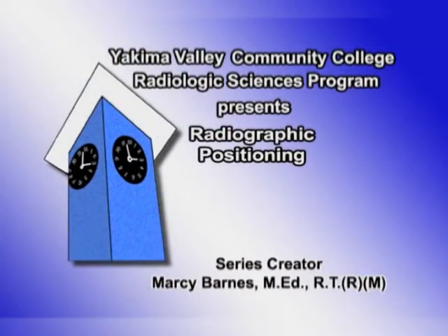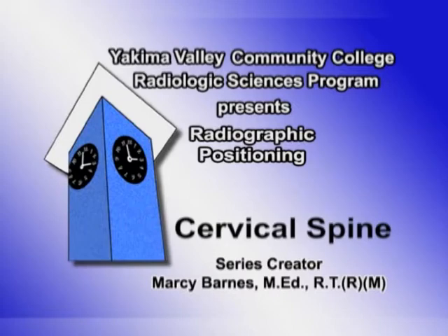Yakima Valley Community College Radiologic Sciences Program presents Radiographic Positioning. The cervical spine.